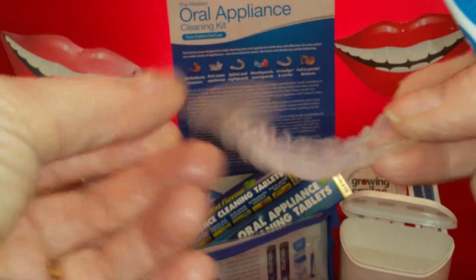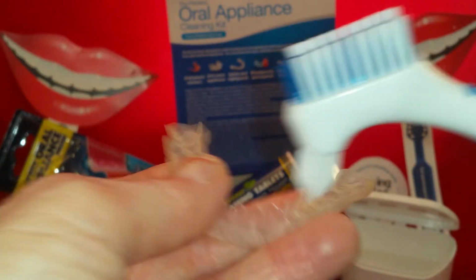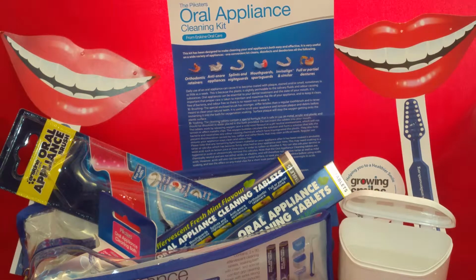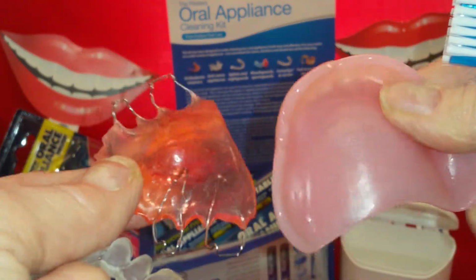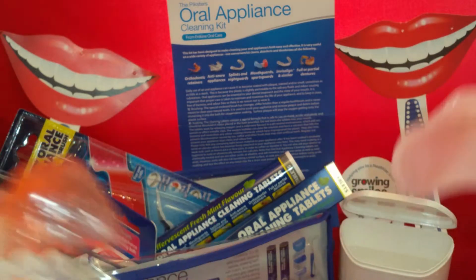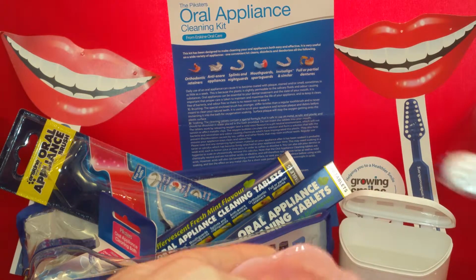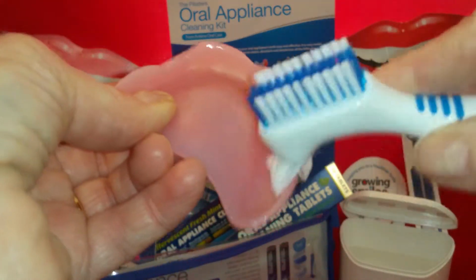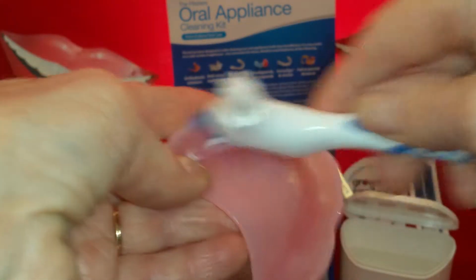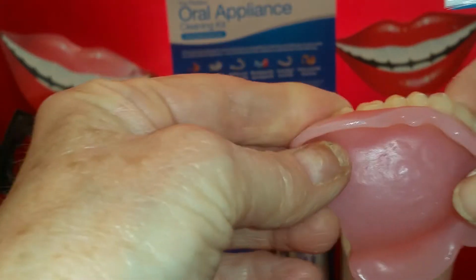So where are you going to use it and how are you going to use it? First of all, rinse your appliance underneath the tap. Give it a jolly good clean with this. If you've got a denture, you want to clean it over a basin full of water, because if you drop these more solid pieces of oral appliance on an enamel sink, they will break. So put some water in the bottom of the sink before you start cleaning. Use this end to get in around all the nooks and crannies, particularly the bits that are going to fit against your teeth or your gum surfaces, okay? Make sure it's as clean as you physically can get it.